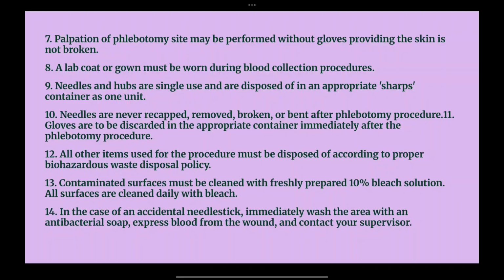So you have to check before you put your hand on it. Without gloves, you are not supposed to touch the region where there is an infection or an injury, because there is a chance that the patient might have infected blood. So it is essential to see the phlebotomy site.